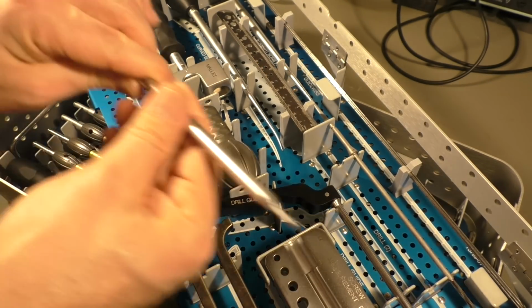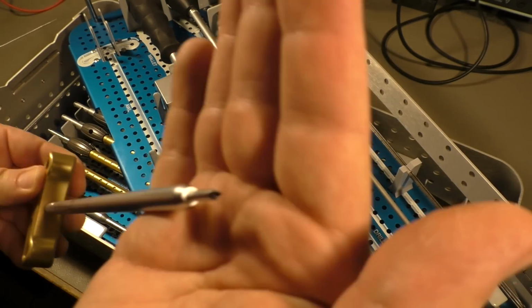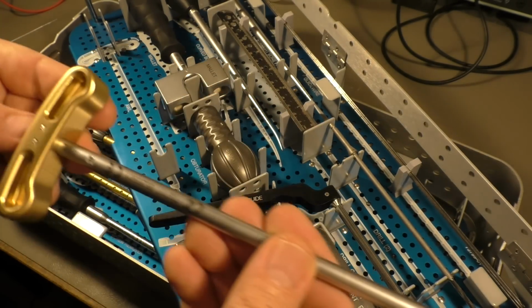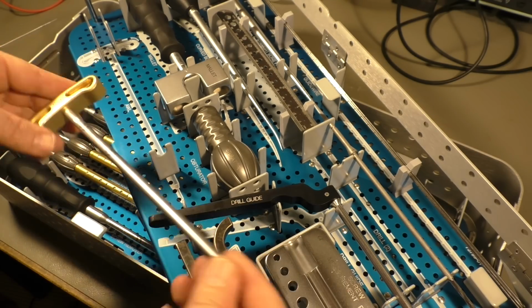What else do we have? An awl to pre-drill holes. That looks quite dangerous. I must say all these tools here make the impression as if they have never been used before.